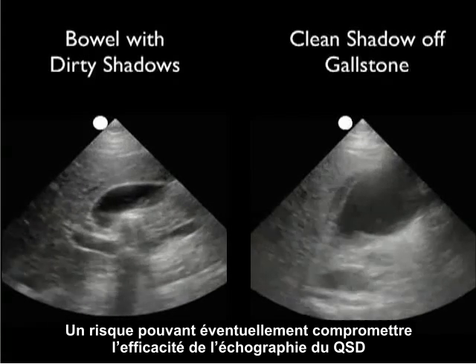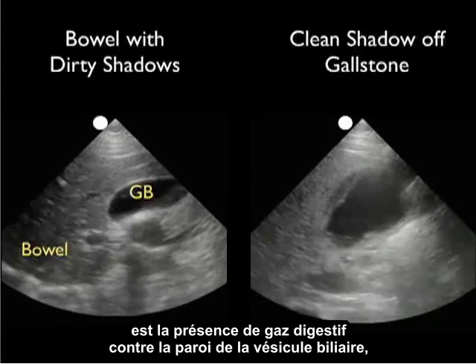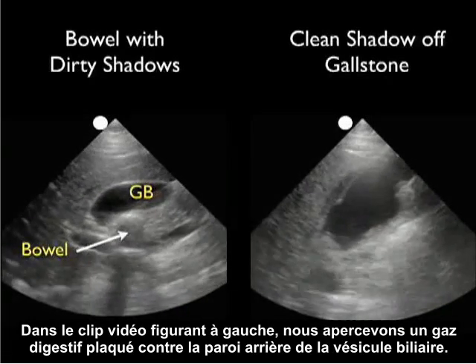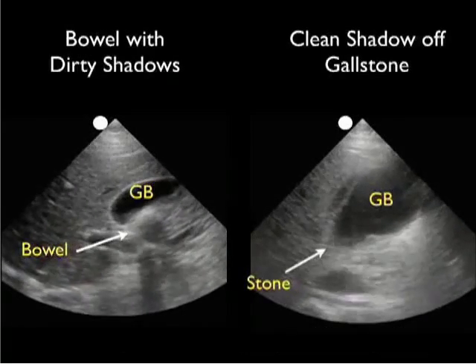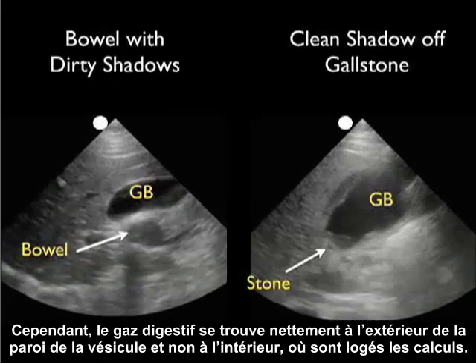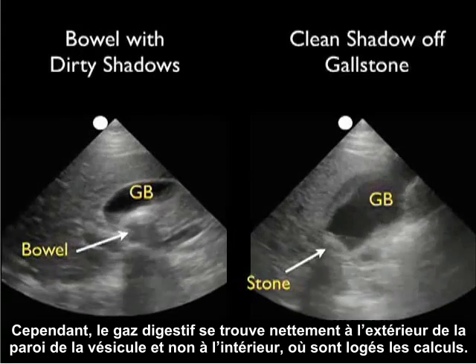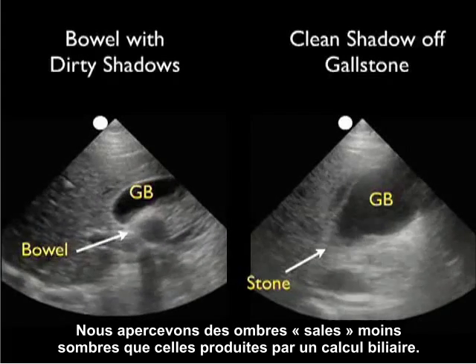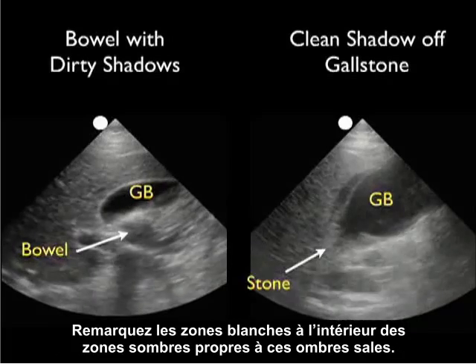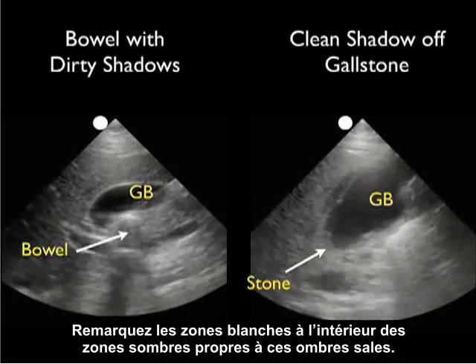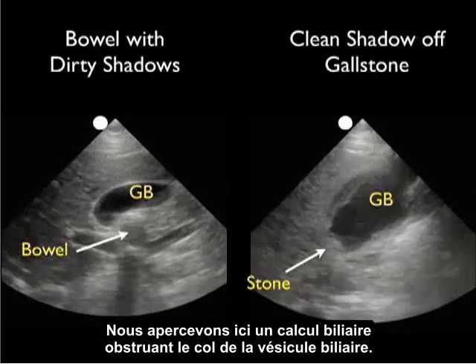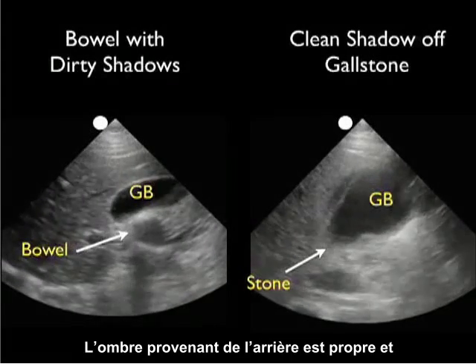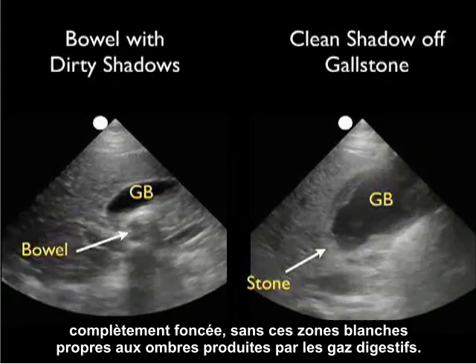One potential pitfall in right upper quadrant sonography is that a loop of bowel may come right up against the wall of the gallbladder and be mistaken for a gallstone. In the video clip to the left we see a loop of bowel against the posterior wall of the gallbladder with a bright hyperechoic appearance that could be mistaken for a gallstone. However, the loop of bowel is clearly outside the gallbladder wall. Also notice the dirty shadows coming off the air-filled bowel — not completely dark, with areas of white within the dark — characterizing a dirty shadow. In the clip to the right, an impacted gallstone at the neck has a hyperechoic appearance clearly within the lumen of the gallbladder, and the shadow off the back is a clean shadow, completely dark without the light areas that characterize air shadows.